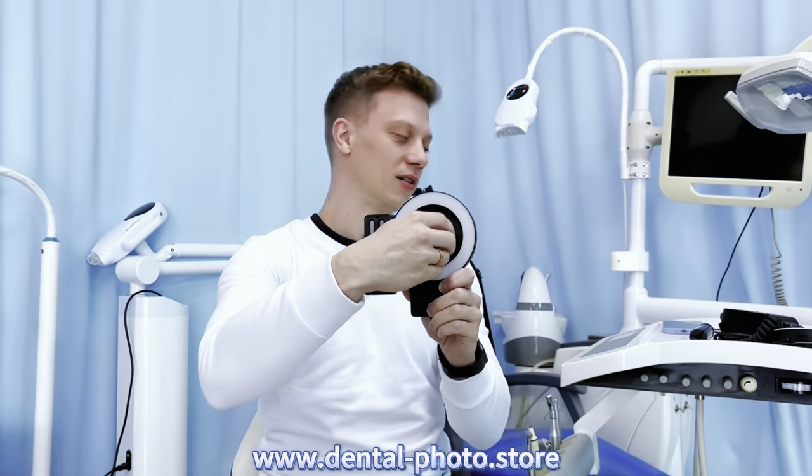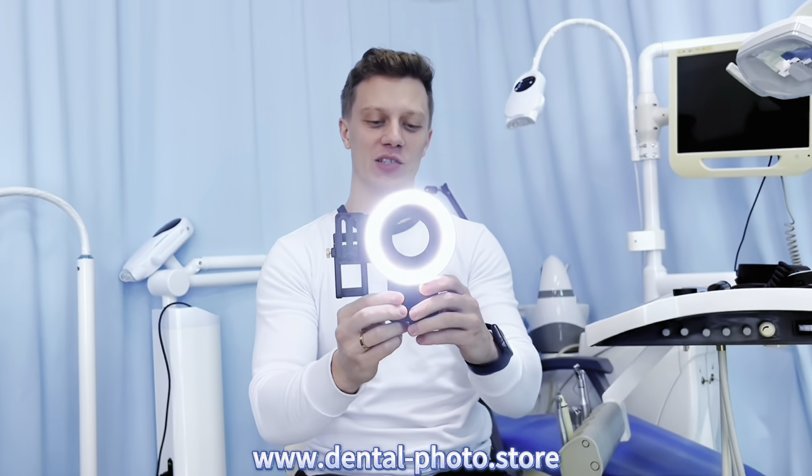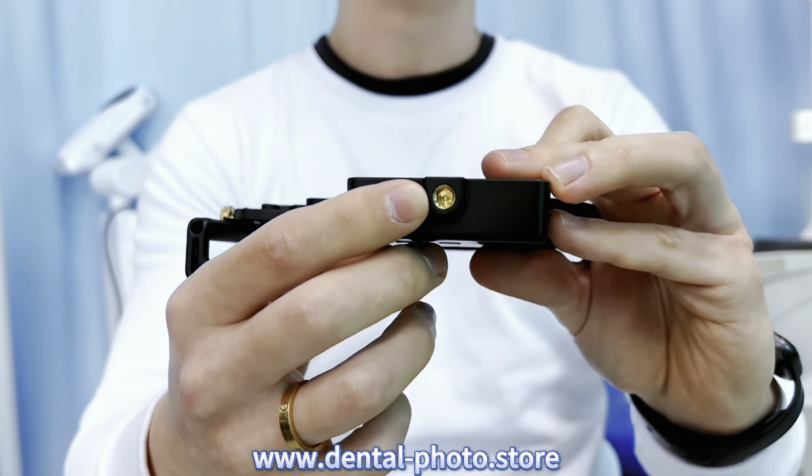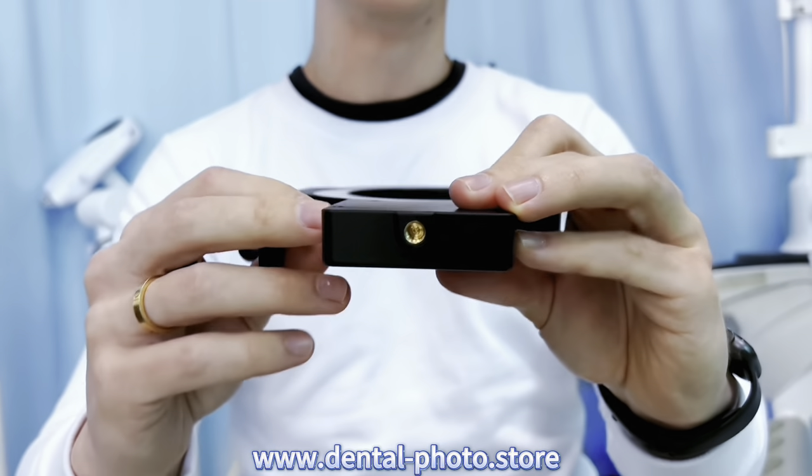There are three color temperature modes. You can choose between cold light, warm light, or mixed light. And of course you can change the brightness of the light. At the bottom there is a thread — this is the standard thread that you can use with any kind of tripod or handles.